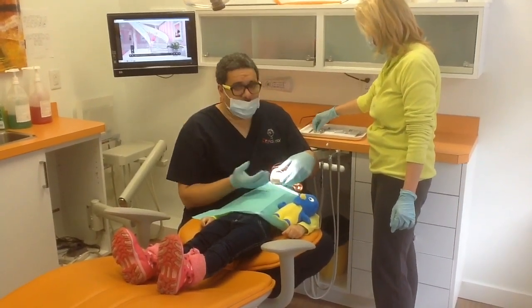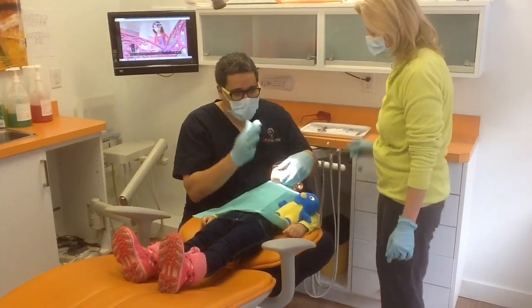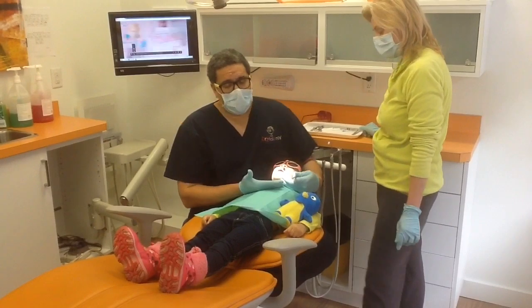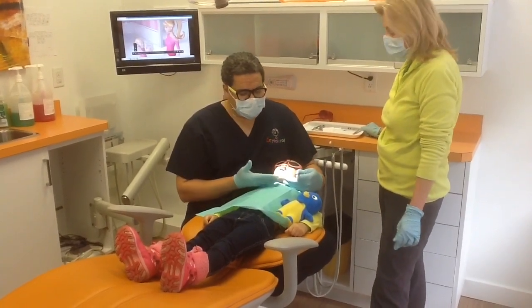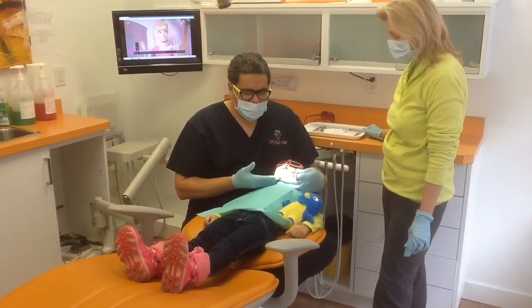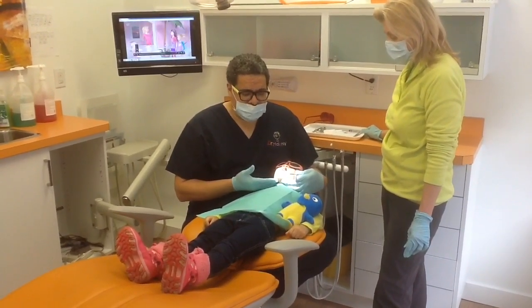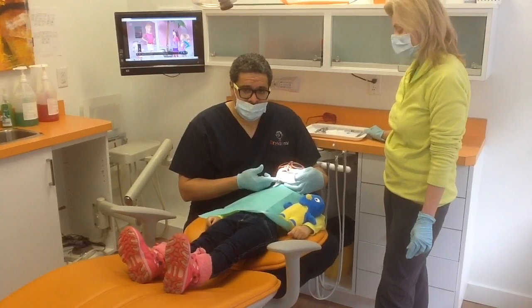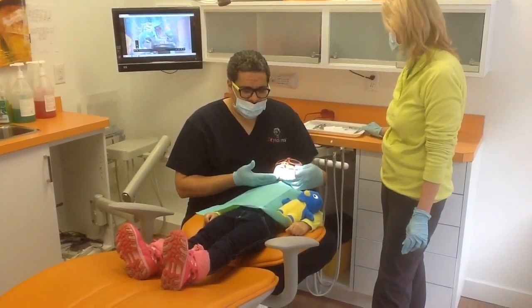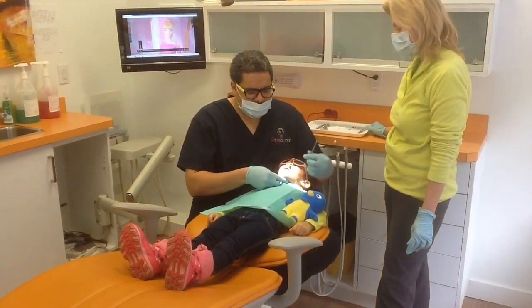The second thing we're going to do is get the mirror. With the mirror, you never want to put anything in your fingers or anything in the patient's mouth carelessly. My hand positioning is always underneath the chin. You don't want to squeeze any soft tissues — you always want to guide the patient's face gently to where you want to go, at the symphysis of the chin or the angle of the mandible. You never want to pinch any soft tissues.